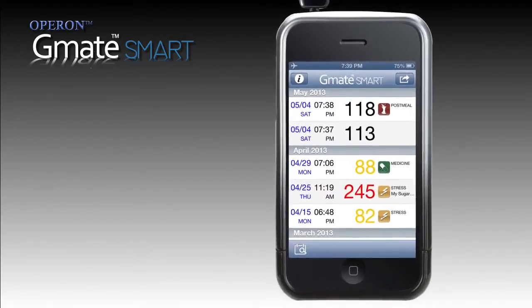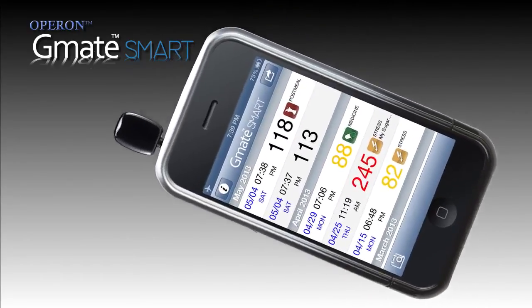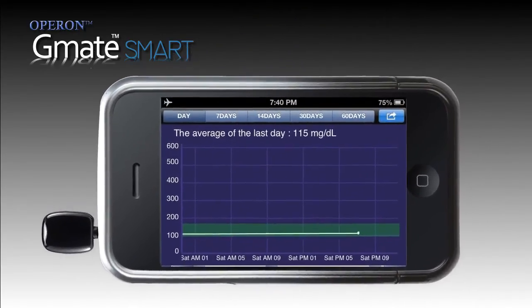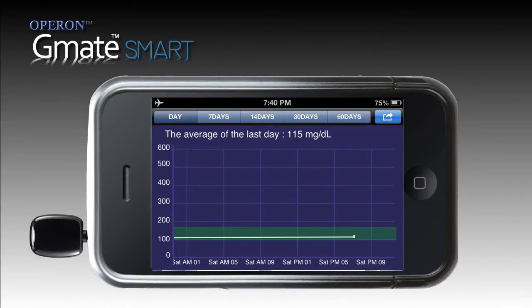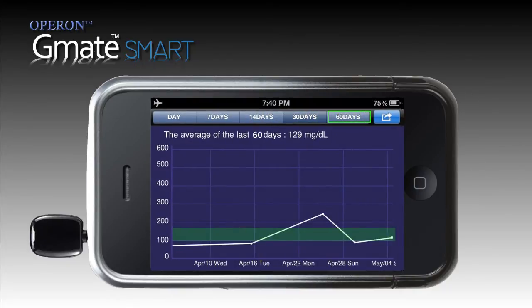You will see the last record on the top of the list. Turn your smart meter to horizontal position and the values will turn into a graph showing your present average and past averages. Select the period you wish to see from the top list and the graph gets automatically adjusted to your selection.